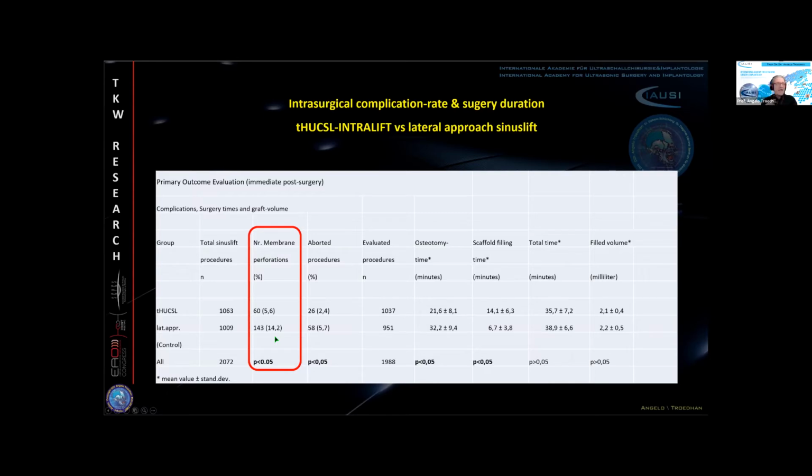And I always remind you, if you carefully read the literature, you will see reports of sinus membrane perforations up to 25–30% at some investigation locations, even great universities where ENT doctors then checked the sinus membrane intactness after the surgery by the oral maxillofacial surgeons. So of course, we have 3 times higher safety against perforation with the INTRALIFT method than with the lateral approach method.